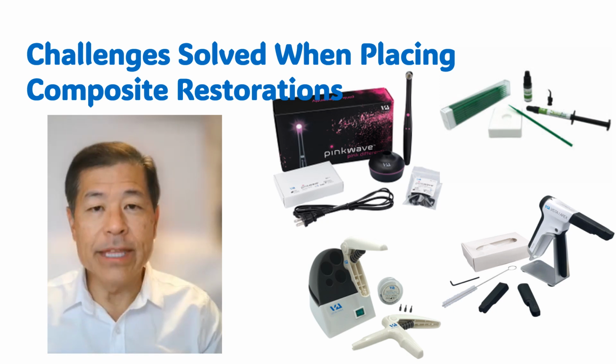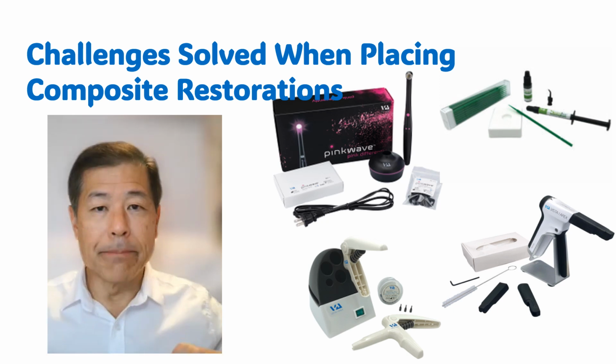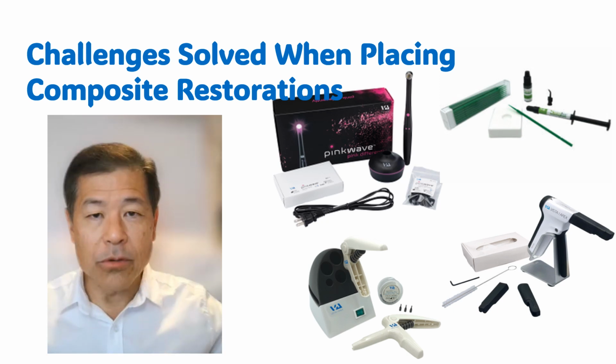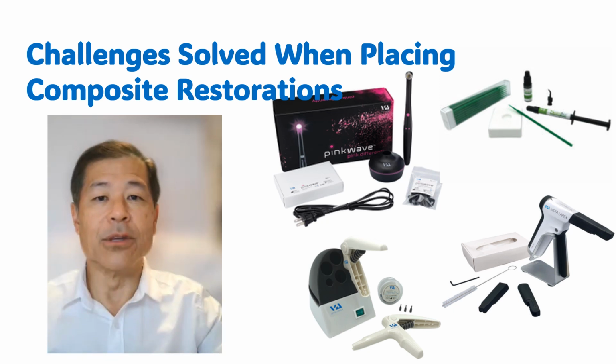And as you spread that out over the tooth, it's kind of like if you take a baking roller and you roll across dough. Sometimes the dough kind of sticks to the roller, and as you're trying to flatten it out, it starts to roll up behind the roller. I don't know if you've ever had that happen.